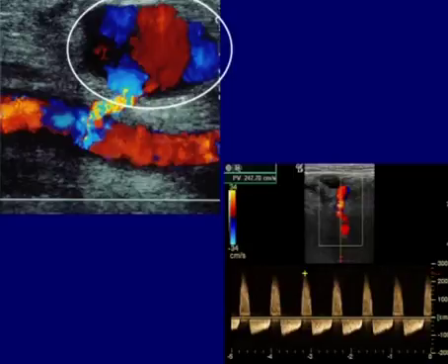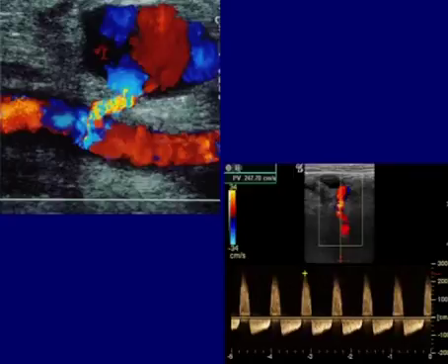What's important to note really is how big this is. Do we see any thrombus already? How does this track look? How does this neck look? Is it very wide? Is it very long or short? Some of that information is important regarding the treatment of these patients.